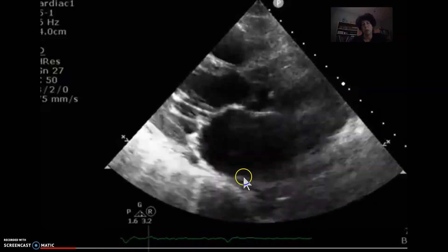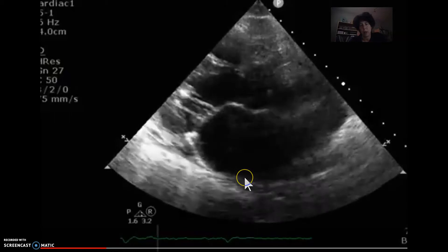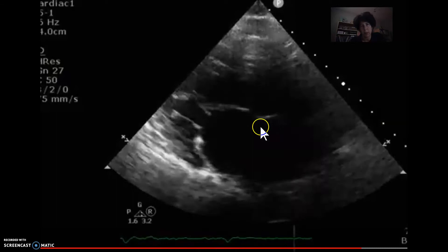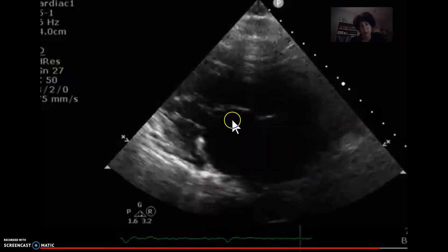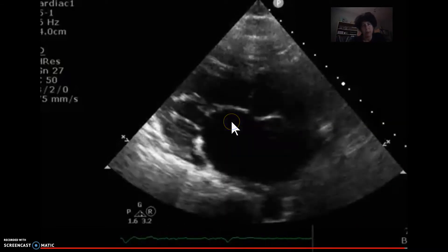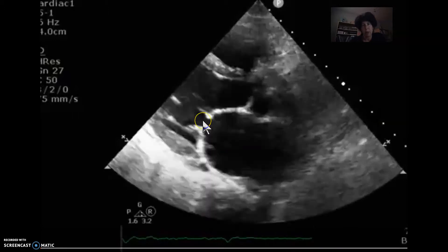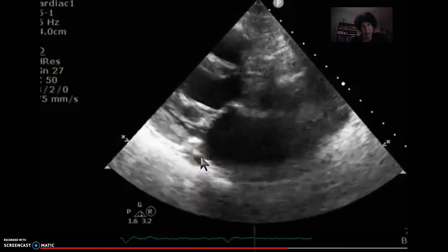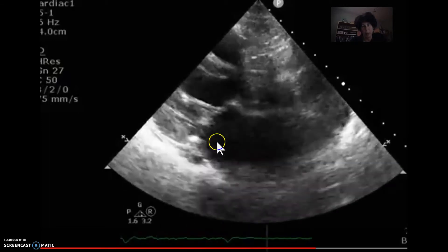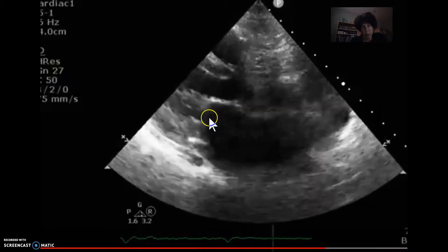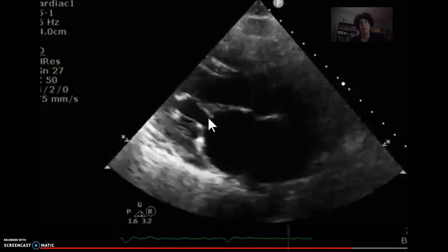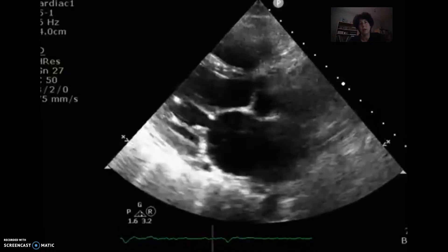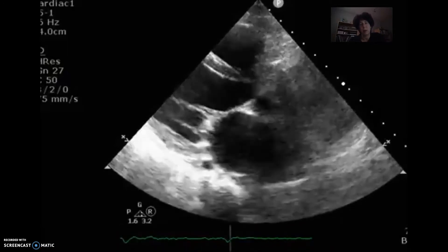Usually when we look at comparative sizes, the LA and aorta in this view should be about the same size — so this LA looks enlarged to me. Looking at the mitral valve opening, the mitral actually looks bright, which might imply some degree of mitral dysfunction. But this mitral valve is for sure not opening properly, so we have to wonder if there is some degree of low flow state going on here.